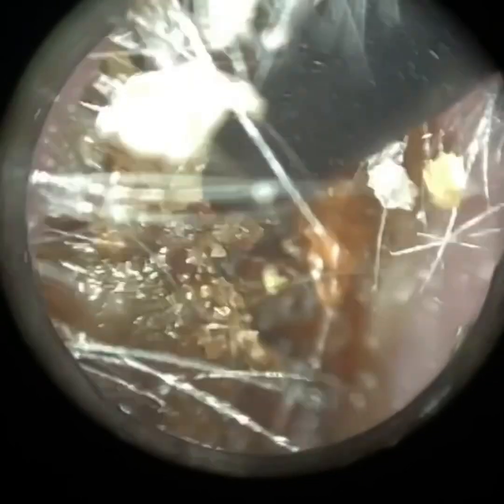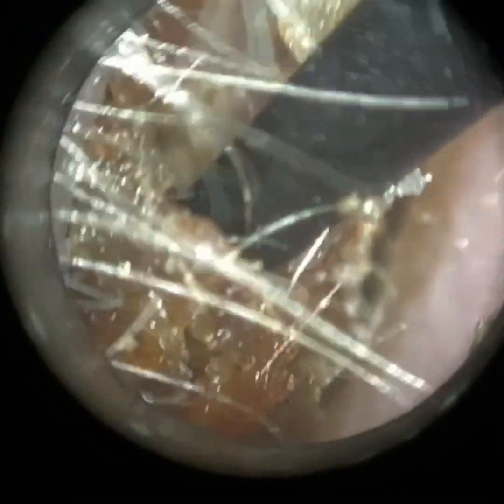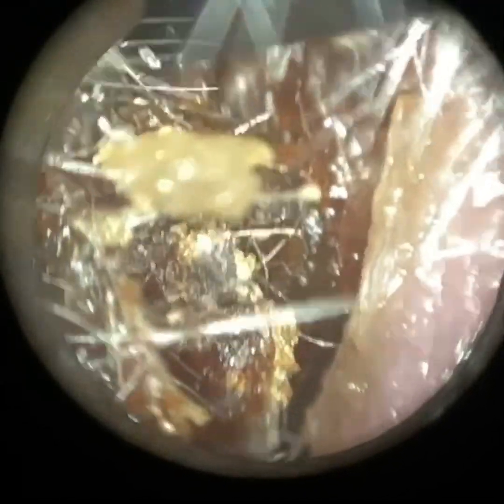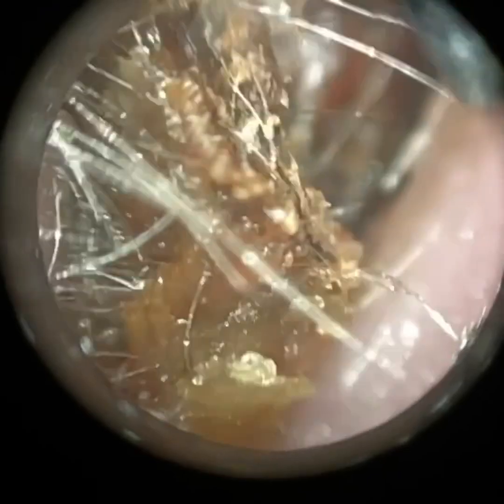So I'm just going with the right-angled earhook. I've managed to penetrate it, but similarly to their left ear, it's a bit crumbly at the core, so it's just dissected it. If it's less dry — when it's dry it can get really crumbly — so if it had a bit more sebum or cerumen, which is the oily sweat, it may have held this together a bit more like fudge, and we could have extracted it. So I'm just trying to break it into little pieces.